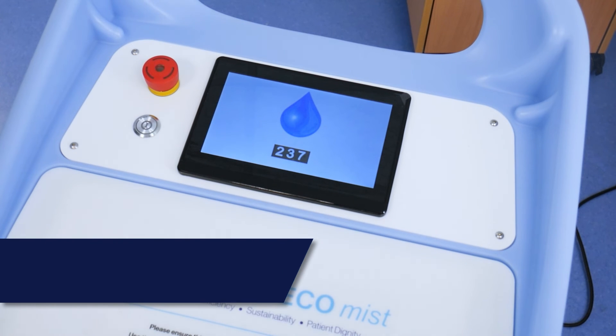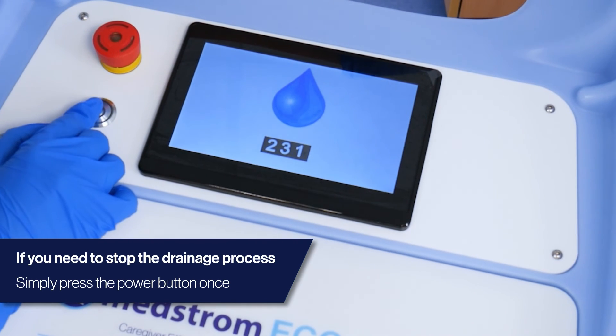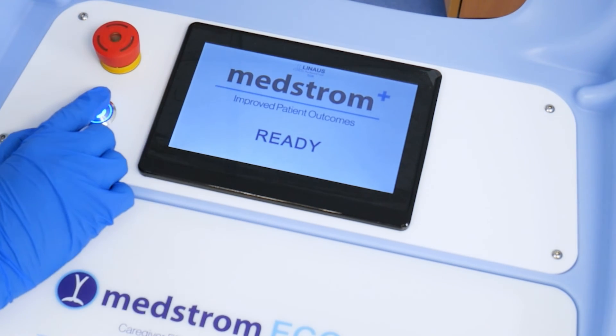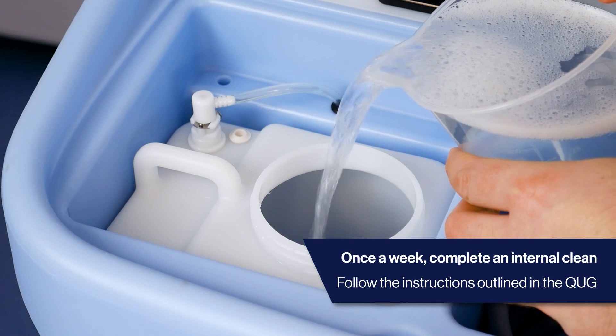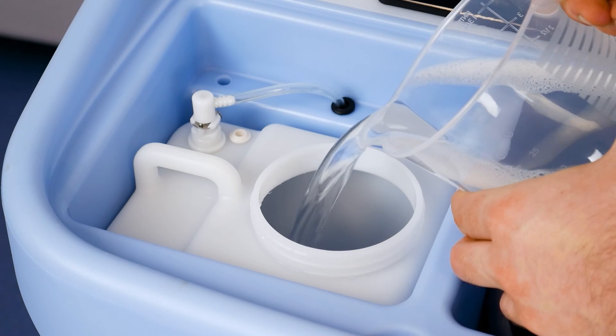Please note: if you need to stop the draining process at any point, press the power button once and the initiation will begin again. Please note: once a week, the hydraulic system needs to be disinfected internally. Please follow the process outlined in the quick user guide found on the lid of the EcoMist.